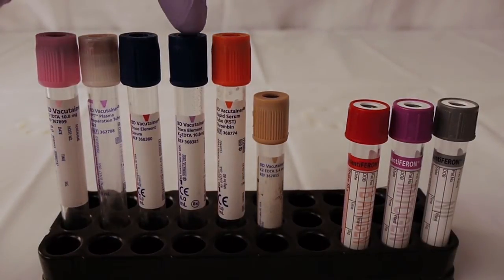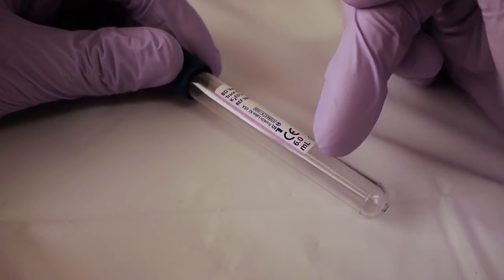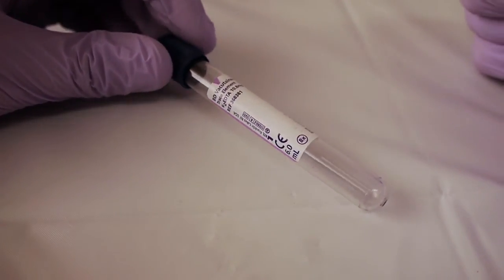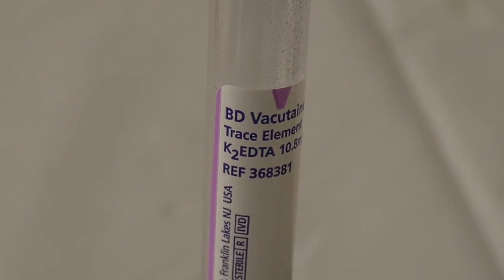The next tube, blue top, has a lavender stripe down the side. That indicates this is going to be an anticoagulant. This tube has EDTA. Used for the exact same test, it will just give you plasma instead of serum.